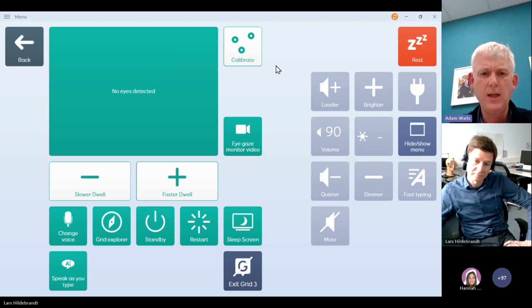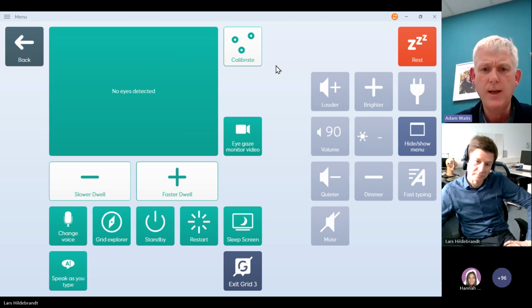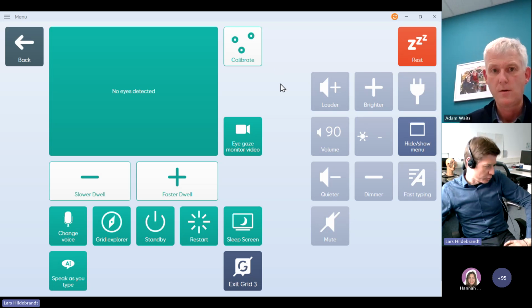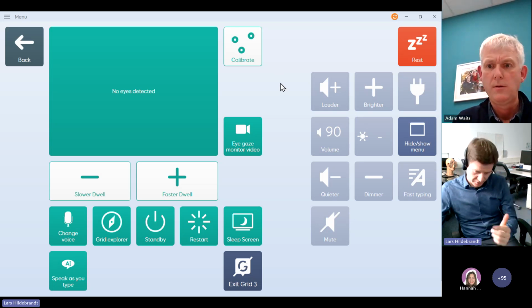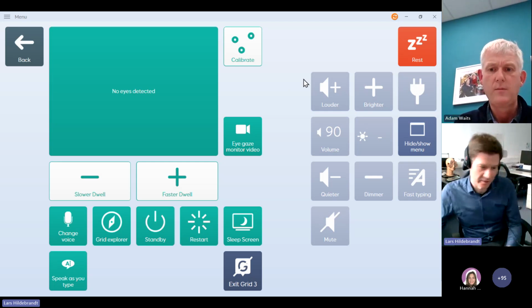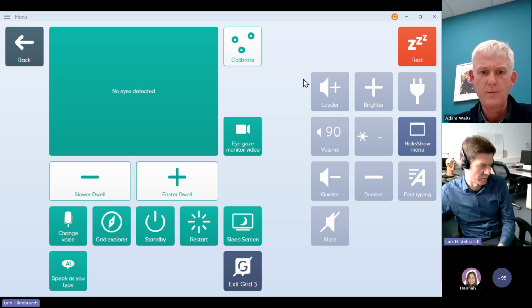And then from Ashley, if the device is for one user and they access Grid and Windows throughout the day, should IntelliGaze be set as the calibration software mode in Grid? I think the answer to that is yes. Set it to IntelliGaze because you're switching between really two different applications, and we want them to use the same calibration and to load the same calibration. As soon as you break out to IntelliGaze, no matter if it's just one user on that PC, then you need to set the calibration to IntelliGaze. Otherwise, it's not sharing the calibration between both worlds.